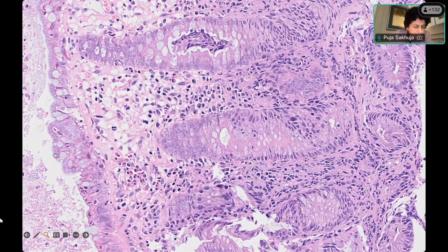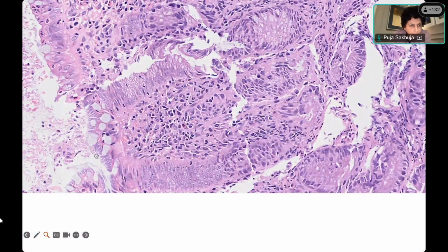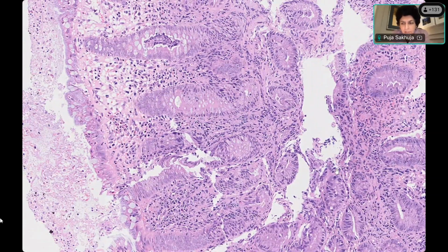But what are we seeing here? A fuzzy border. Can you see this fuzzy border, which is not normal, correct? If you see this fuzzy border, you need to rule out the presence of spirochete infection. And how can we confirm that? By what stain? Silver stain. Warthin-Starry silver stain, correct. So Warthin-Starry stain can be done to confirm this.